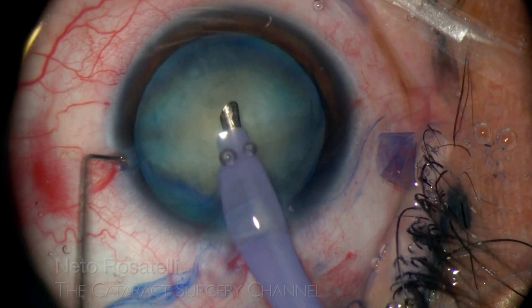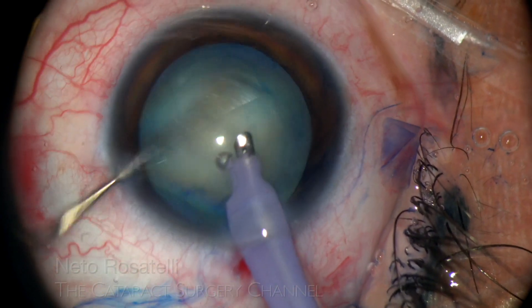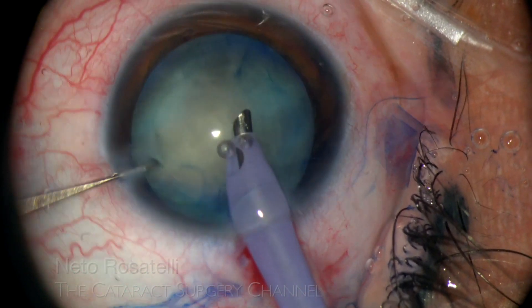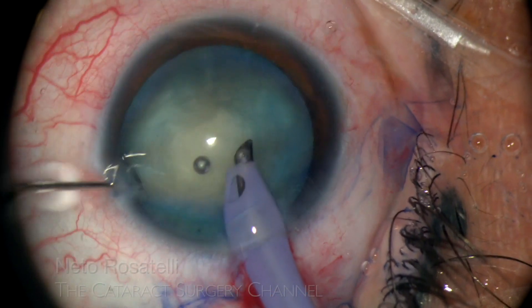Subsequently, a vigorous nucleus spinning is done, as this maneuver greatly helps releasing existing cortex from the capsule. This is very zonular friendly, despite looking a little rough.